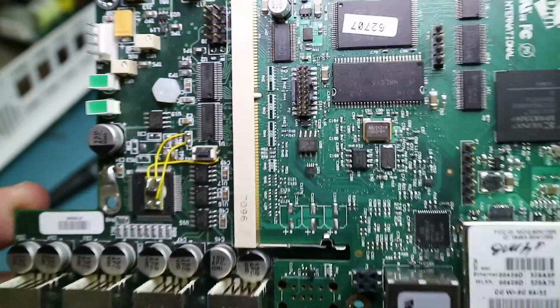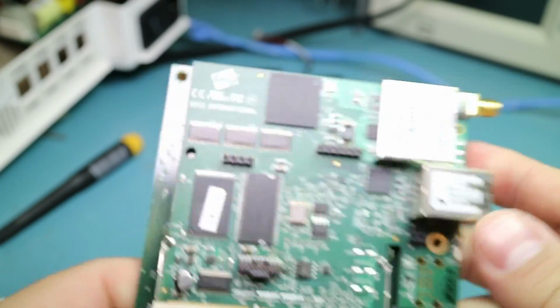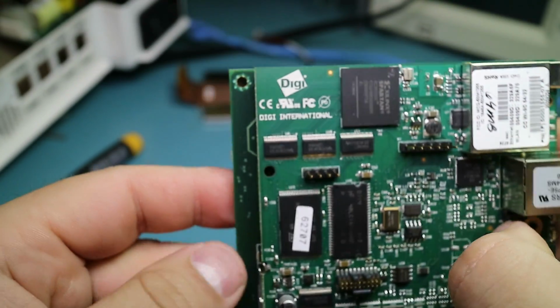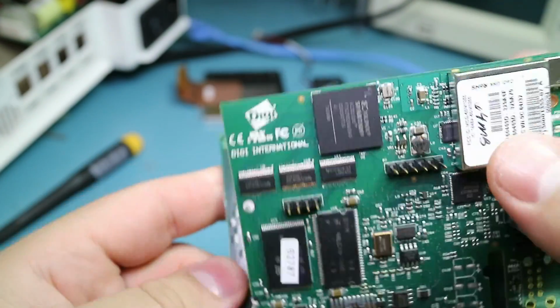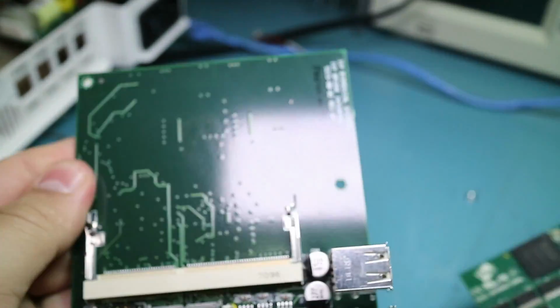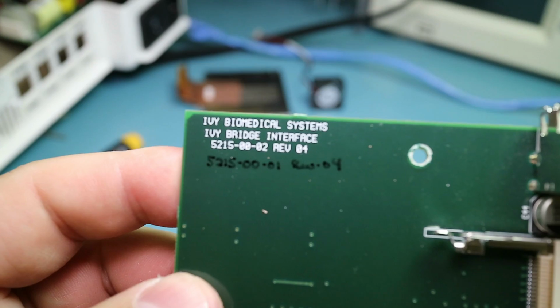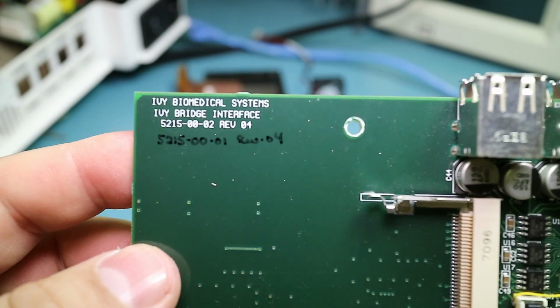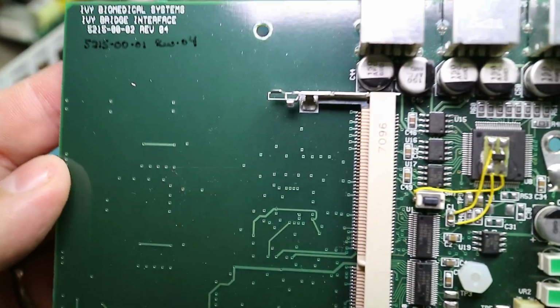And we've also got the main board, and the main board is made by Digi International. And I'm going to take this out. It's a bought-in card at the top, which we'll take a look at. And we've also got the Ivy Biomedical Systems Ivy Bridge interface. So this looks like the only thing that they've actually made. This is something they've bought in, and we'll look at the data sheets and stuff for that. But this is the thing that they've actually made, and it's what contains all the USB ports.